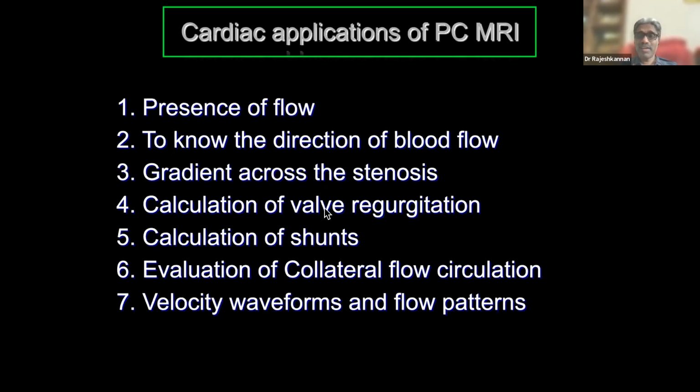We can calculate the valve regurgitation. For the leaking valves, we can calculate regurgitant volume and regurgitant fraction. We can also calculate the shunt by looking at the QP and the QS. We can also use the PC flow to assess the collateral flow circulation.